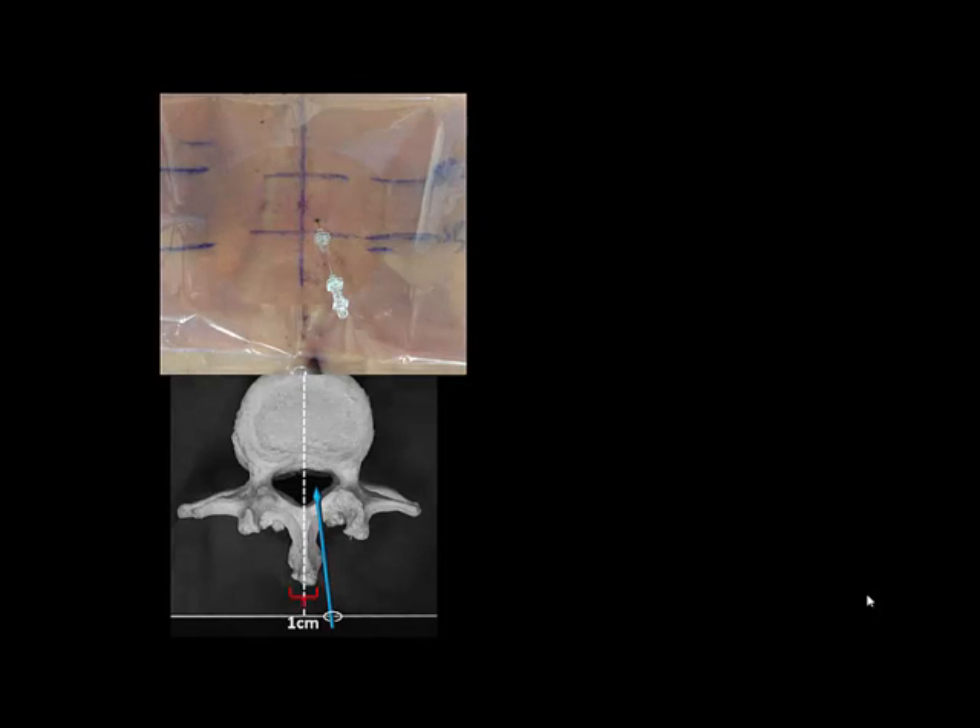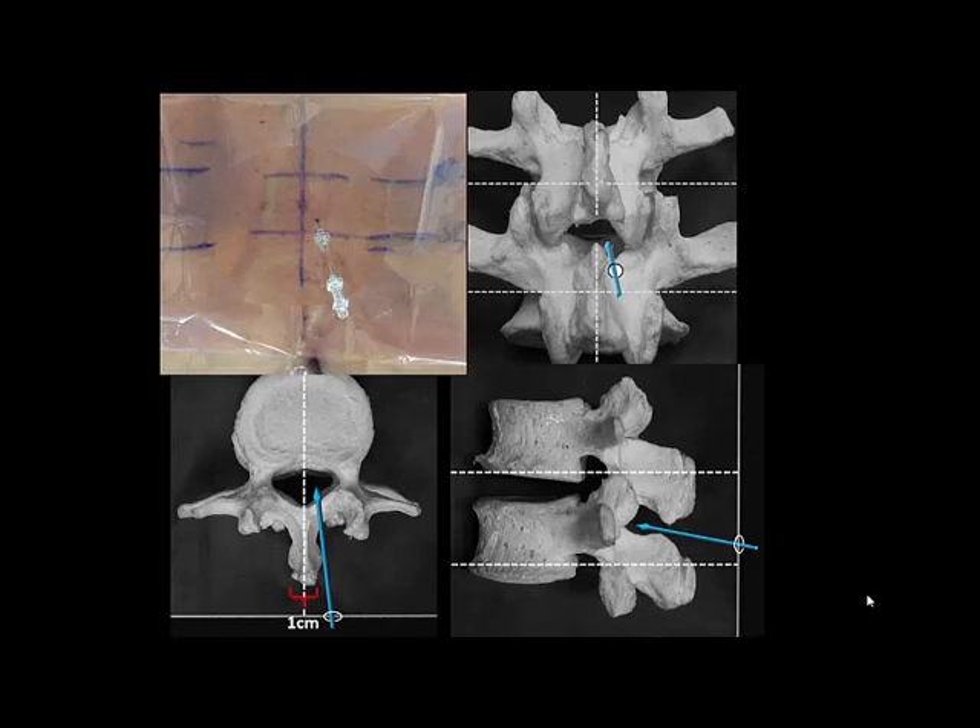The average adult lumbar spinous process is about one centimeter wide in its lateral dimension and the needle is thus inserted immediately alongside the spinous process, hence the term paraspinous. Medial angulation should be no more than five to ten degrees. The interlaminous space lies between the two spinous processes and is reached by angling the needle cephalad no more than five to ten degrees to begin with.